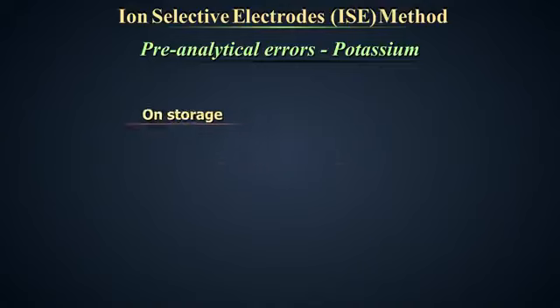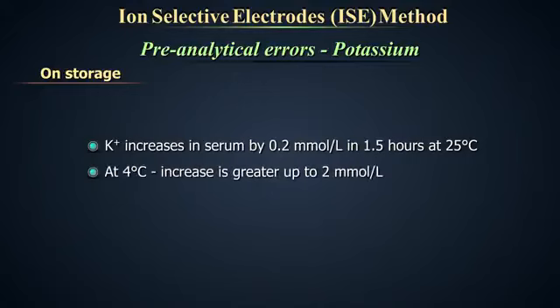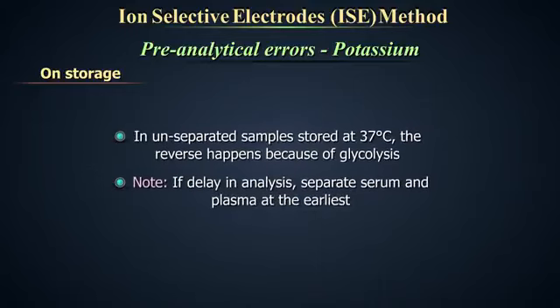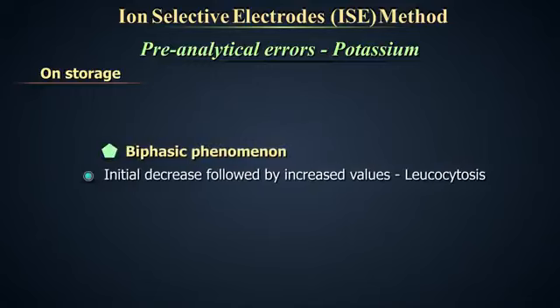Storage, time and temperature. Potassium increases in serum by 0.2 millimoles per liter in 1.5 hours at 25 degrees centigrade. At 4 degrees centigrade, the increase is considerably greater. Up to 2 millimoles per liter increase can happen in serum in 4 hours at 4 degrees centigrade. In unseparated samples stored at 37 degrees centigrade, the reverse can happen because of glycolysis. A biphasic phenomenon, an initial decrease followed by increased values, can happen in the event of leukocytosis.